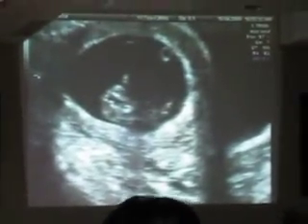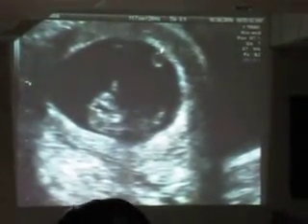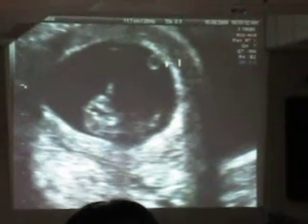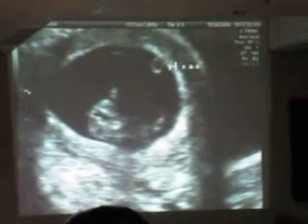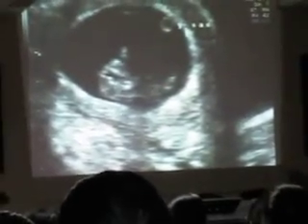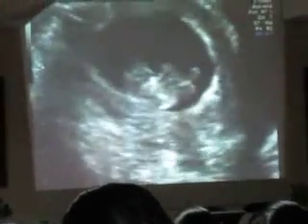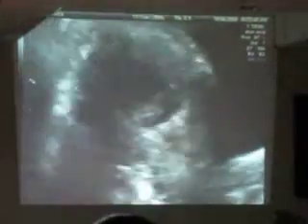2.6. Calculate, I gave you the measurement. Around 9 weeks, 6 days after LMP. According to LMP, she is 10 weeks, 6 days. Okay, 10 weeks, 6 days.